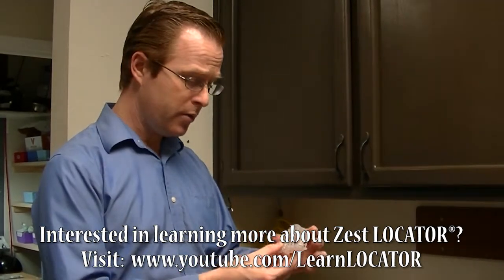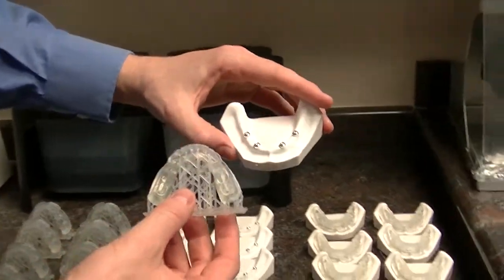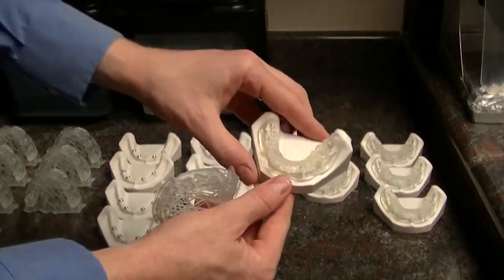What I'm showing you here is this denture, and I wanted to go ahead and fit it to this little model that we have right here. This is our model — it's got four of our locator abutments, and I want to make it look just like this.